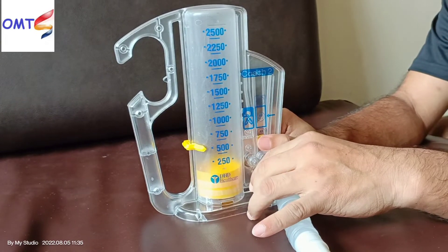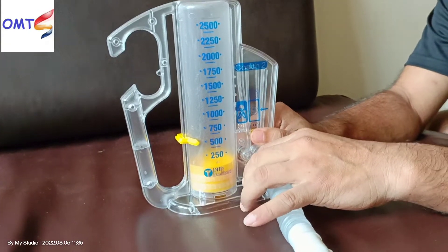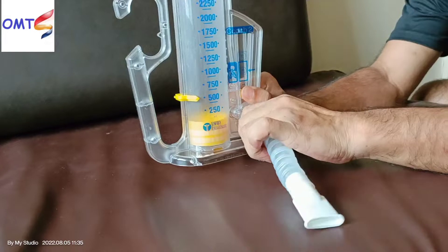I bought this spirometer from the local market. Now I will show you how to set up this machine.